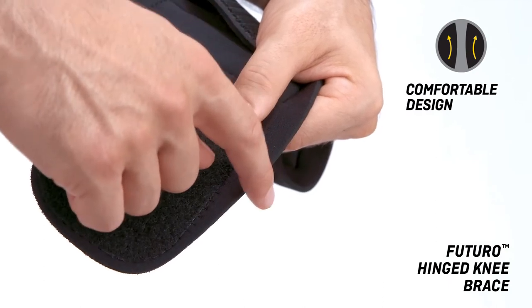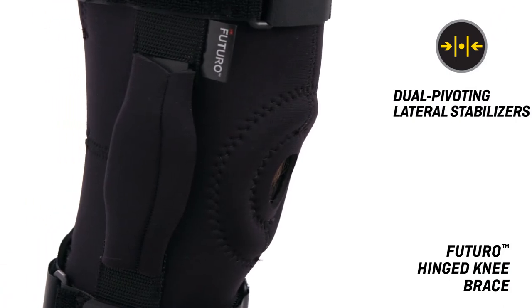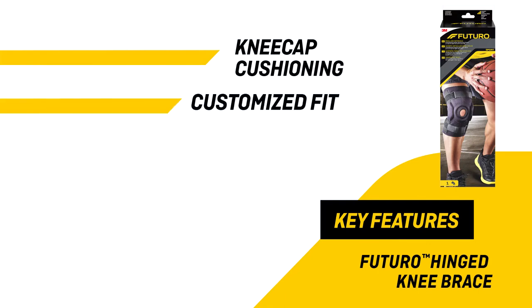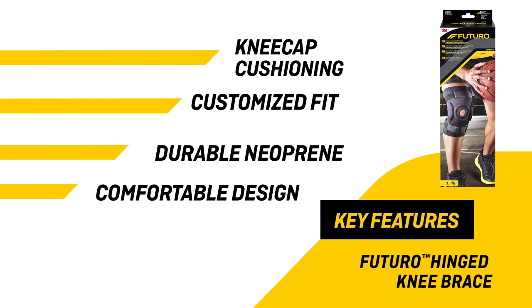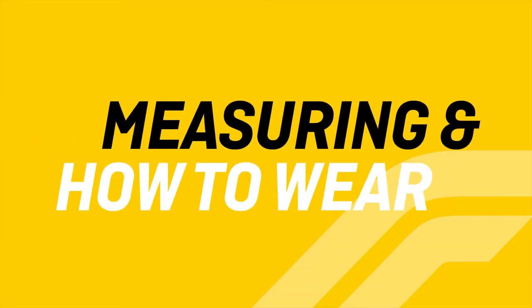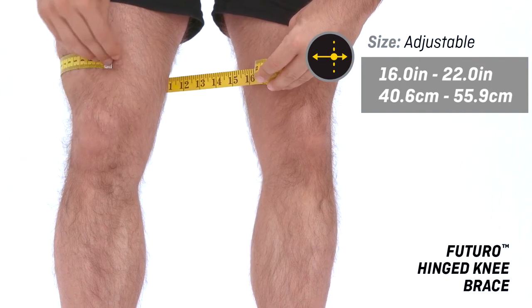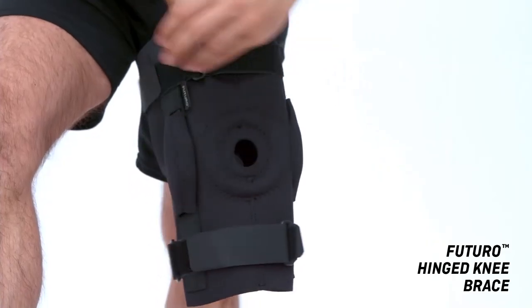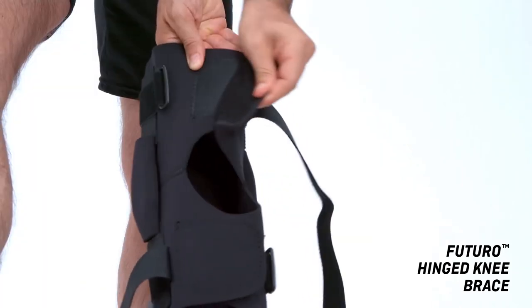Smooth edges and longer length for added comfort. Dual pivoting lateral stabilizers provide rigid support after injury. Fits left or right knee. To fit, measure around the leg three inches, or 7.5 centimeters, above the kneecap. Loosen front straps, open back straps and closures.